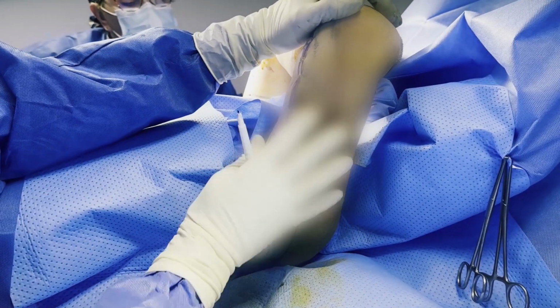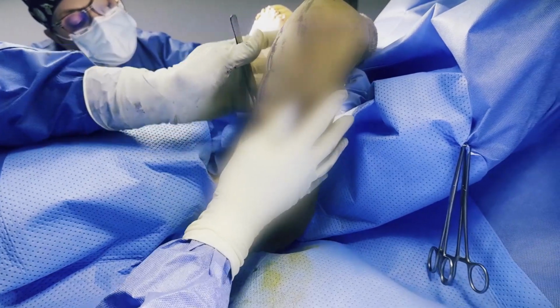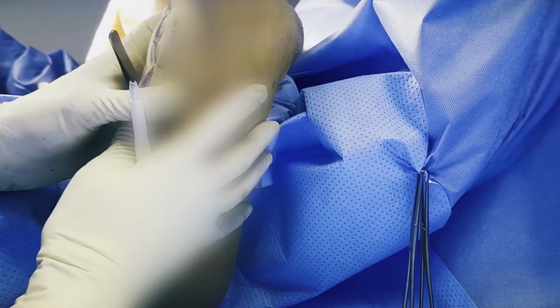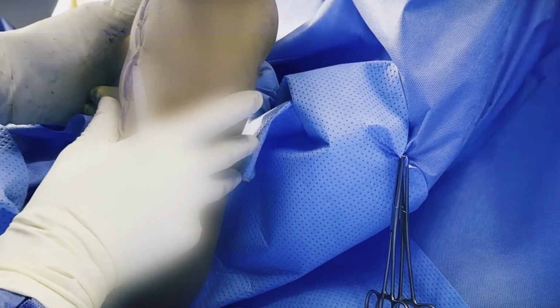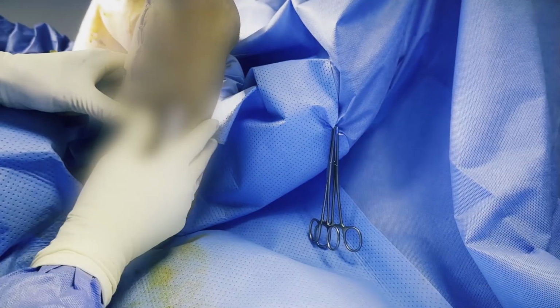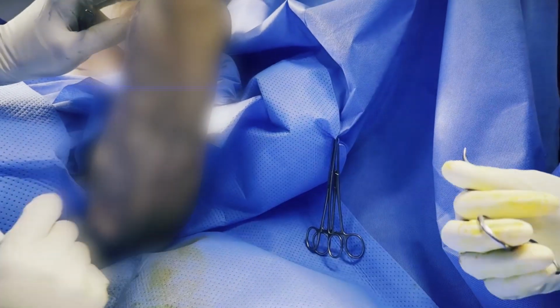So what we did here is called tailor tacking. We tailored that skin to our new contour. The arm is deflated, it's thinner. Now we're just tailoring it because we don't want the oversized comforter on that small bed. So this fits her much better. We're making the new markings here, and then we're going to excise that skin.